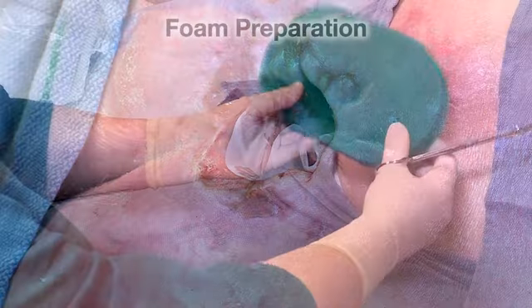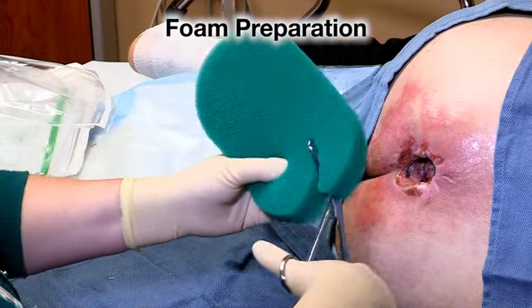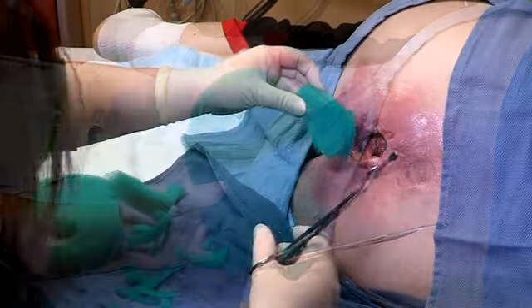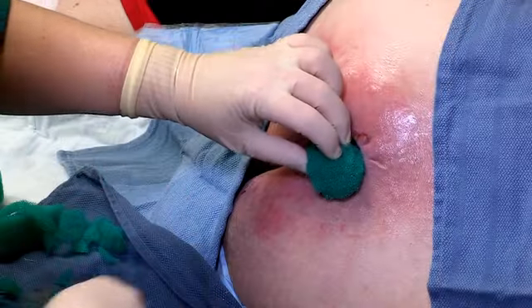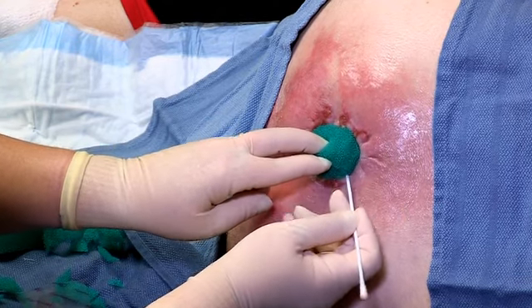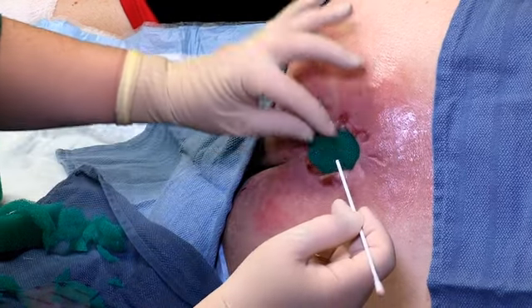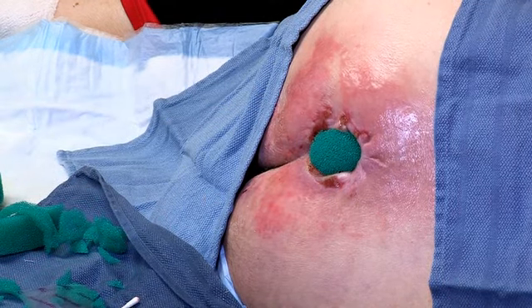To prepare the wound filler, cut the foam into an appropriate size corresponding to the dimensions of the wound cavity. Be careful not to cut the foam over the wound site, as fragments may fall into the wound. Remove any fragments from the foam edges to protect the wound from loose particles. Cut the foam to sufficiently fill the wound cavity without overpacking. Do not overpack wound filler into any area of the wound, as this could damage tissue, affect exudate removal, or affect delivery of negative pressure. Take care not to overlap wound filler onto intact skin.